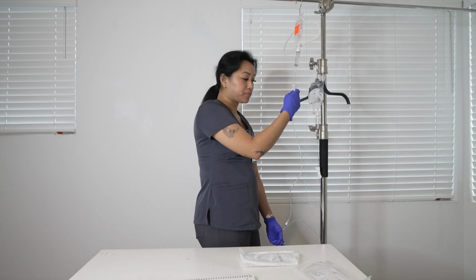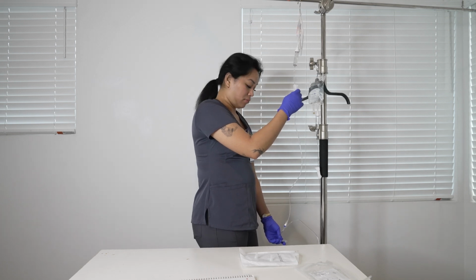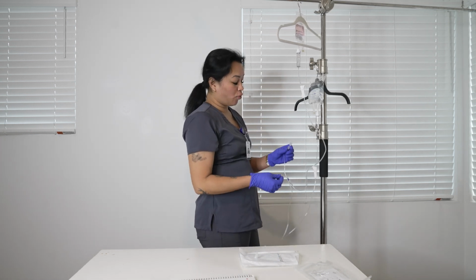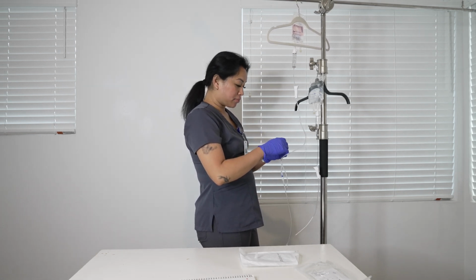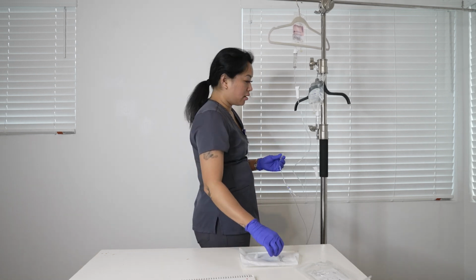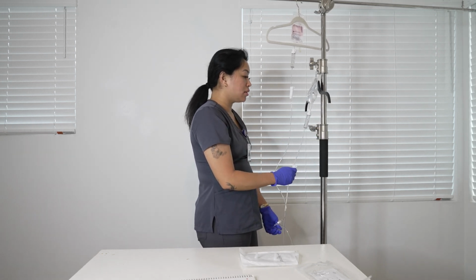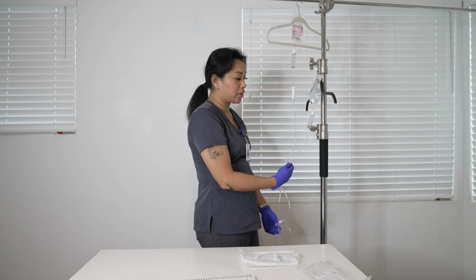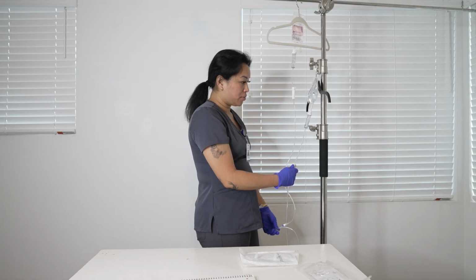Alrighty, so now that there are no air bubbles, now I am going to count a whole minute, so this will be faster. This will be faster, the rate drops per minute. But before I count the whole minute, I am going to unroll the fluids roller clamp, and I will set it at a rate of 38 drops per minute.